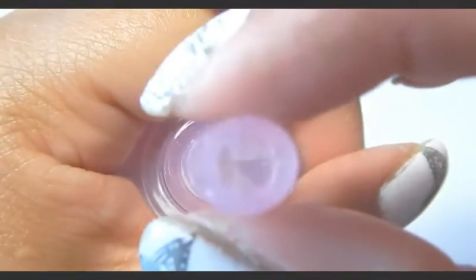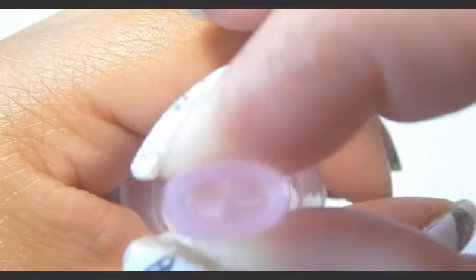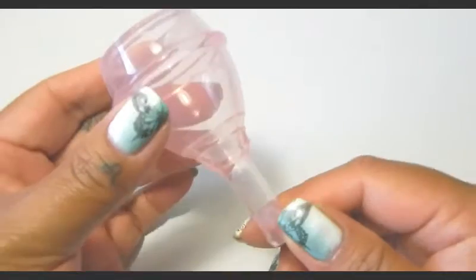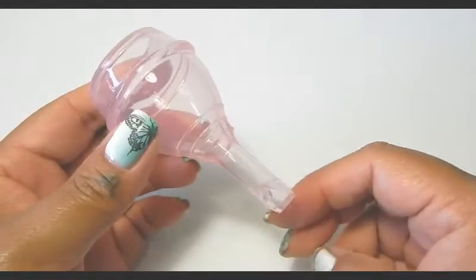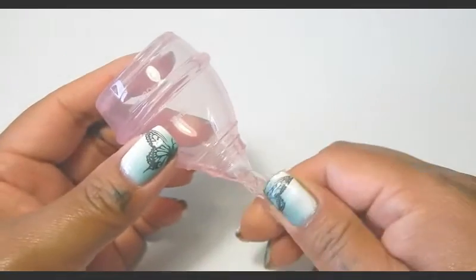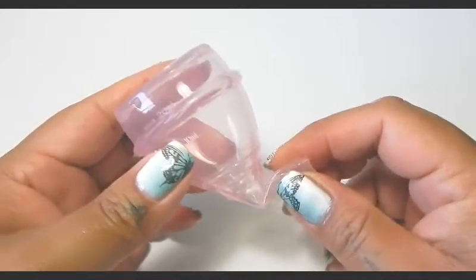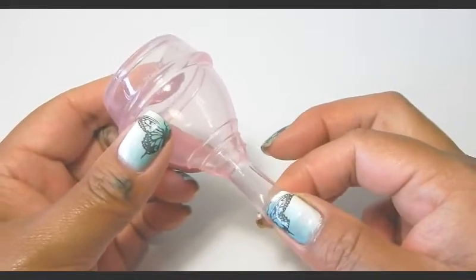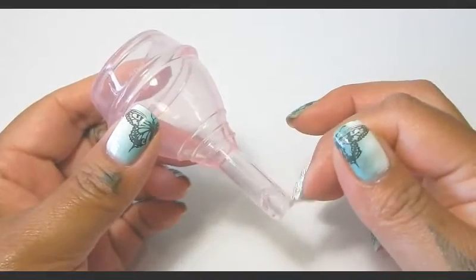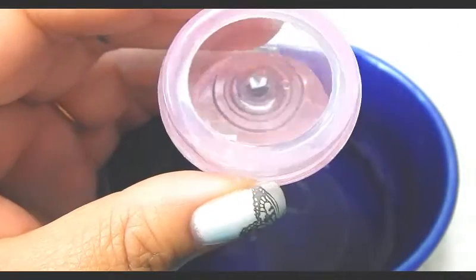If I turn it and push it doesn't open. So I'm going to go ahead and pause this, get a cup of water, fill this cup up so that you can see me turning the stem and bending it over, then demonstrating how to open up the teat for the water to come out.